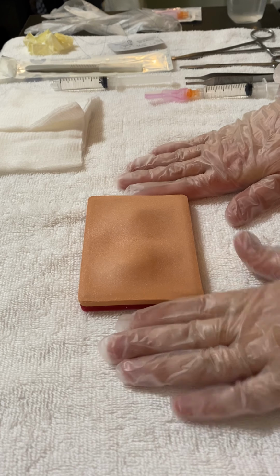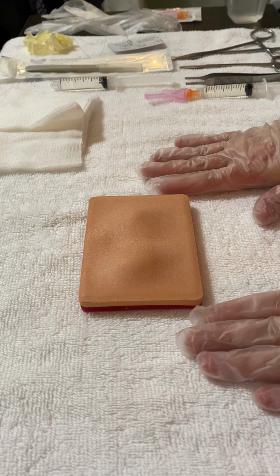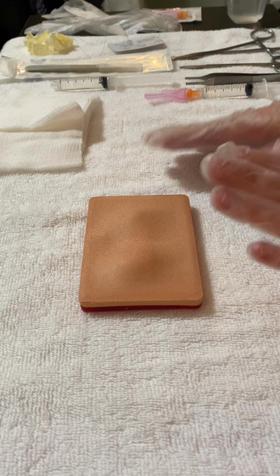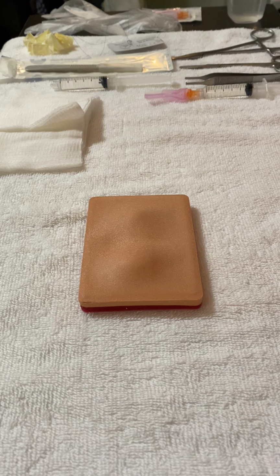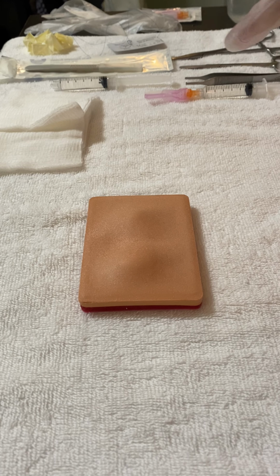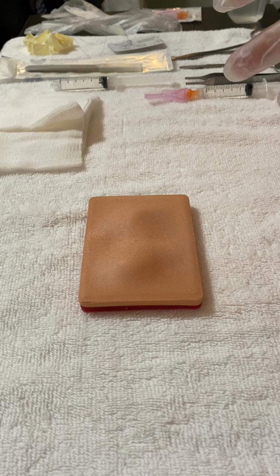My name is Jessica Day, and using this tissue pad simulator, I will be demonstrating the technique for a cyst removal for the class Rural Primary Care 3. So to start with, I would make sure to obtain informed consent from my patient and explain the procedure as well as the risks and benefits.